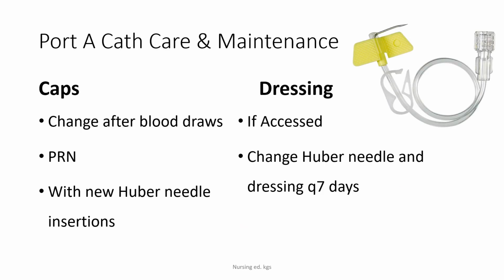When it comes to portacath care and maintenance, you are changing your caps after blood draws, PRN, and anytime you are inserting a new Huber needle or a non-core needle. For dressing change, you're only going to be changing the dressing if it is accessed. So you'll change the Huber or non-core needle and that transparent dressing every 7 days.